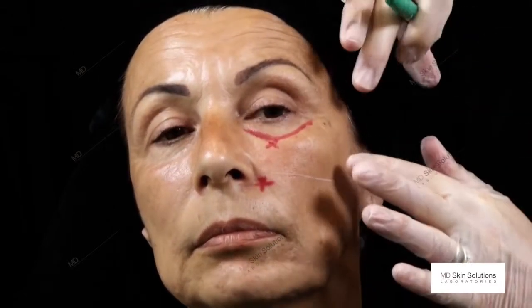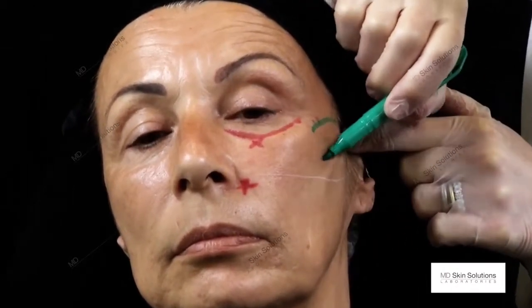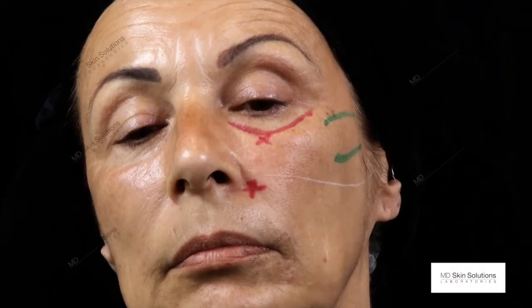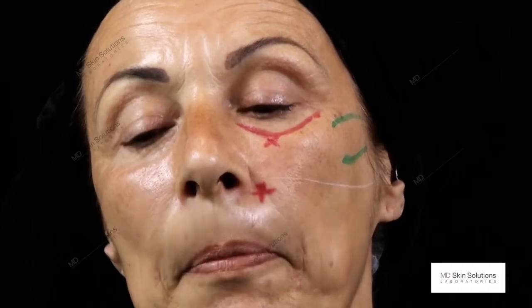The first entry point is defined by the upper and the lower zygoma. The entry point is chosen according to the equipment I use. So in this case, a blunt-tipped cannula.